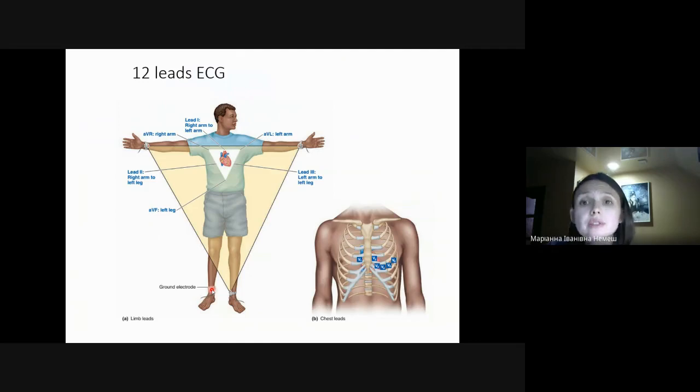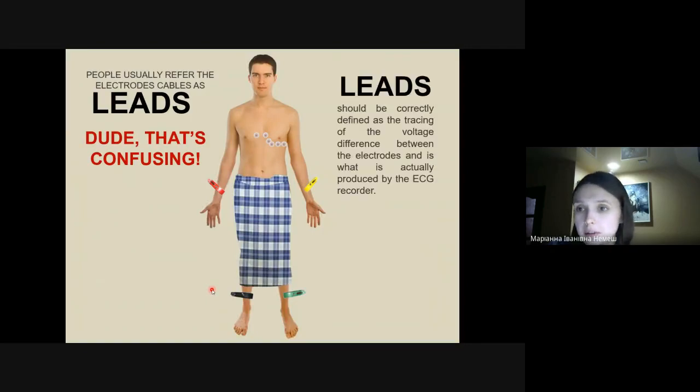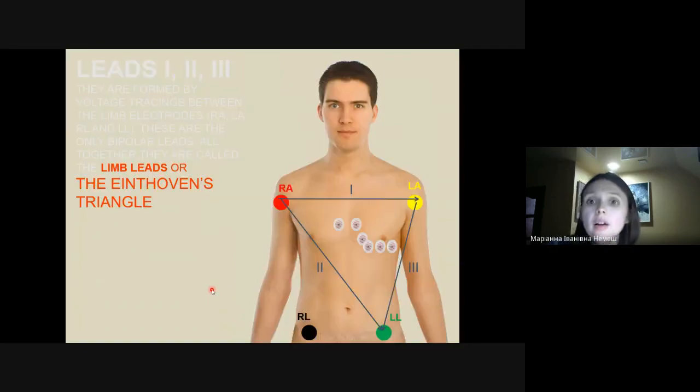Generally, there are 12 leads. Let us discuss the 3 standard leads. The first lead is between the right arm and left arm. The second lead is between the right arm and left leg. And the third lead is between the left arm and left leg.